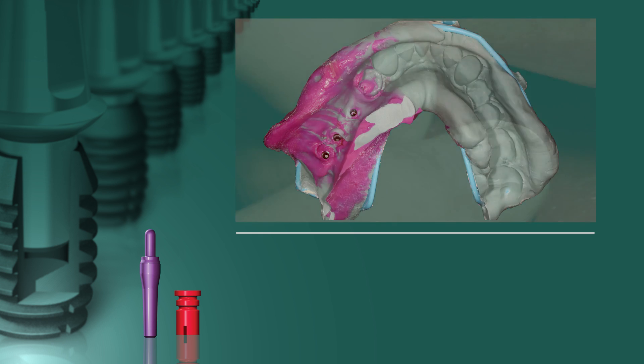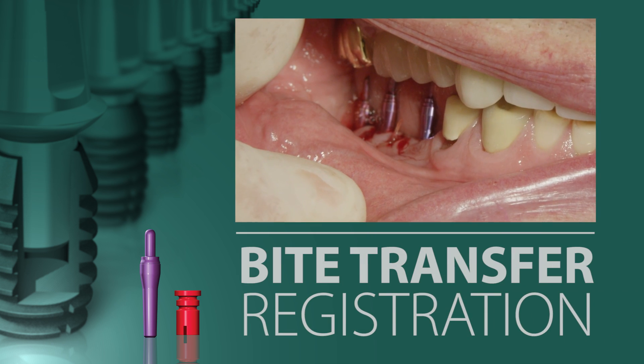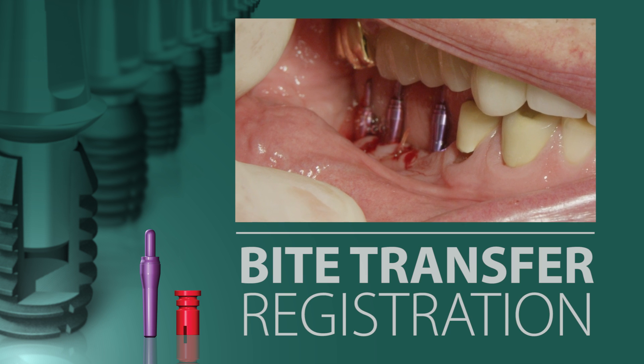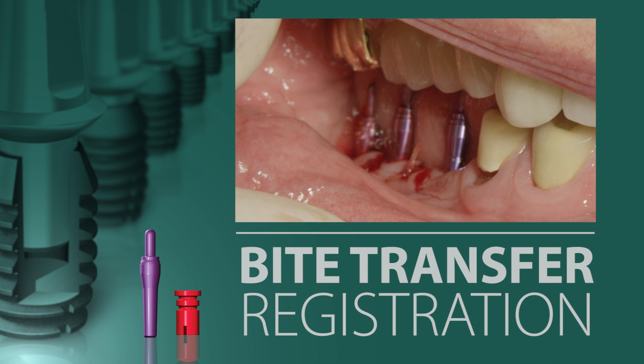Next, we shall record the bite registration. With the three impression posts still in place, the patient is asked to close. Any interfering impression posts are either removed or modified. There is neither sufficient clearance to use the plastic impression sleeves, nor unmodified impression posts.